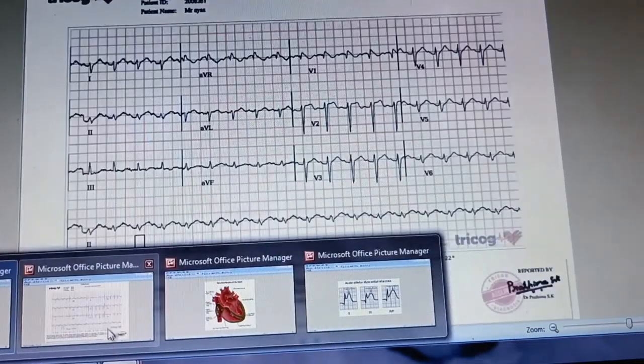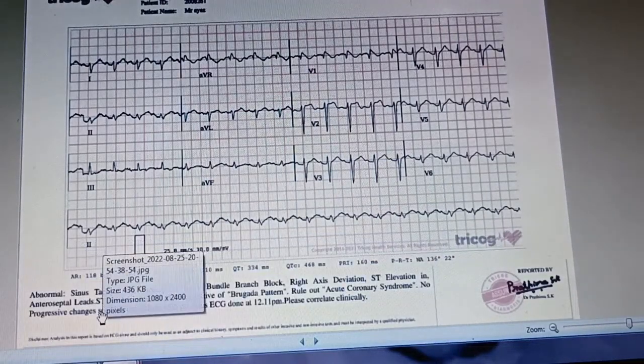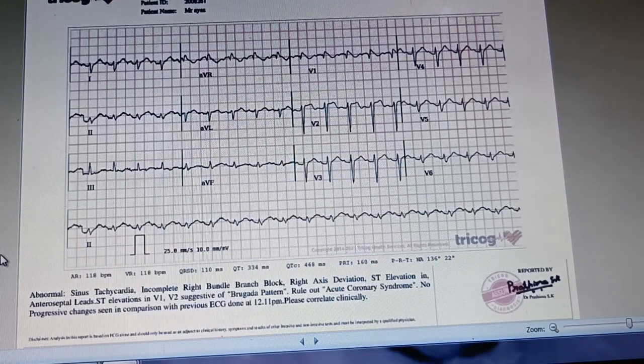observe the graph of the patient, here we will find that the graph is something different. For example, this lead 1 is inverted, and likewise other changes are also present. The graph has summarized its observation in two ways.